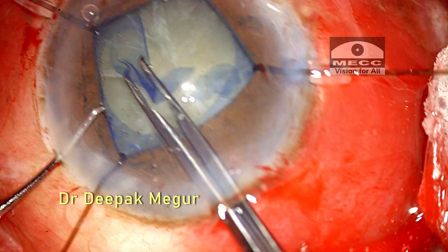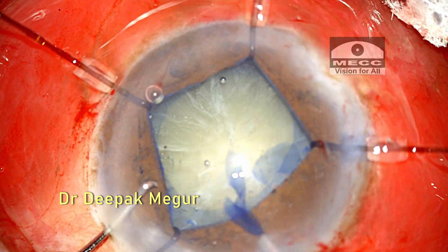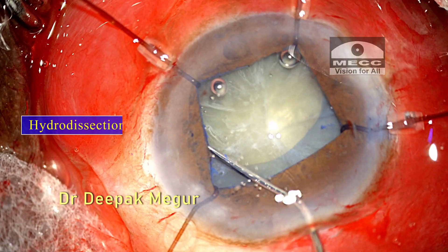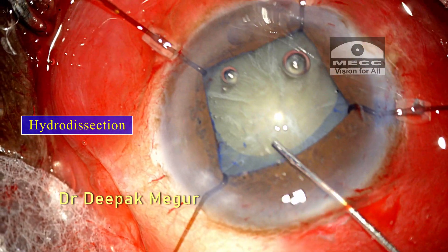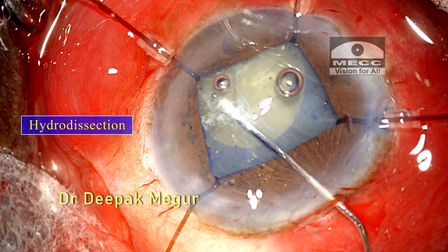The capsule could be torn easily and the rhexis was completed with great ease and control. Hydrodissection is one of the most critical steps in such cases with loose zonules — just trying to ensure that the nucleus is free from its attachments with the bag.